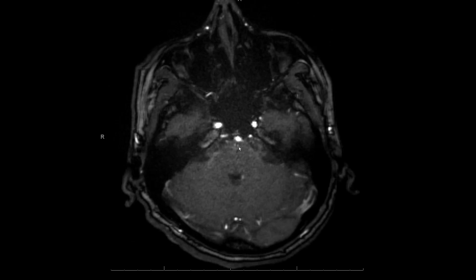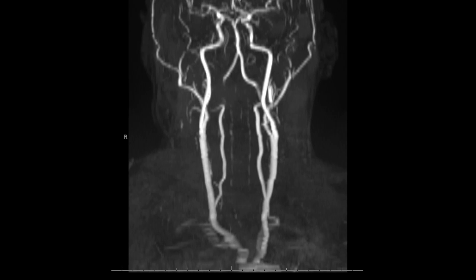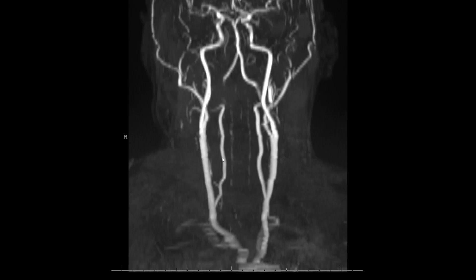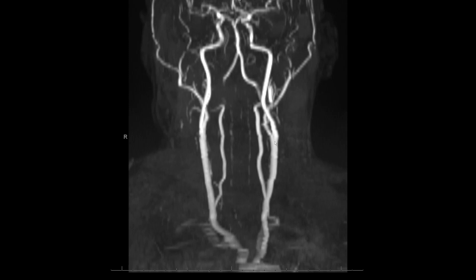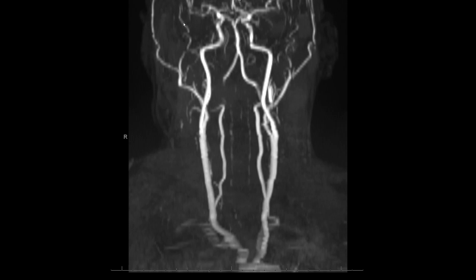Once you are satisfied with your axial images, you can move on to the projectional images. Much like an MRA of the head, for an MRA of the neck you will also frequently get projectional images recreated from the data. These show you different overviews where you can rotate them around and get a general overview. Here you see all of the vessels included — the right common carotid and right carotid bifurcation, the right vertebral artery. You kind of lose it here, likely because the projection was cut off posteriorly, so don't mistake that for an occlusion since we saw it on the axial images. You can also see the left common carotid becoming the external and internal carotids at the bifurcation, and the left vertebral artery becoming the basilar artery, plus a general overview of the intracranial circulation.